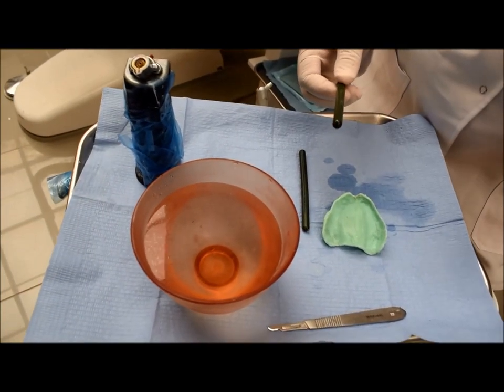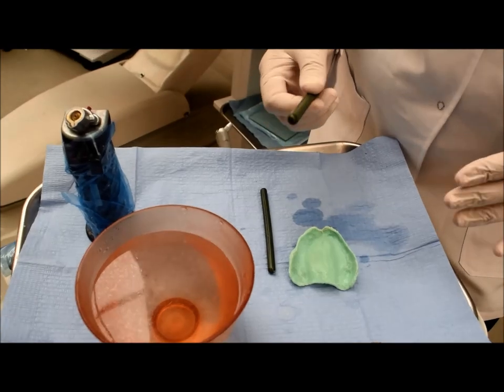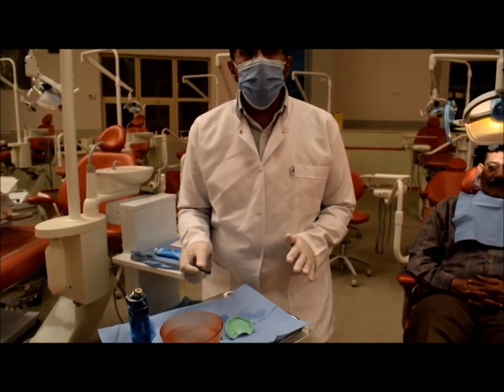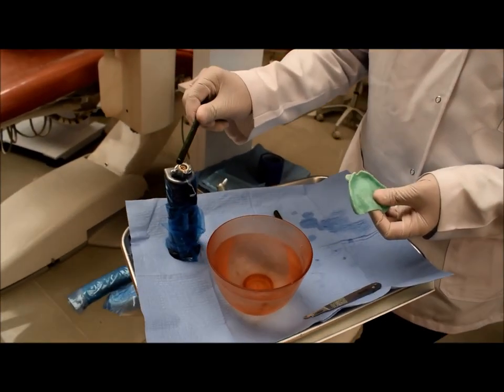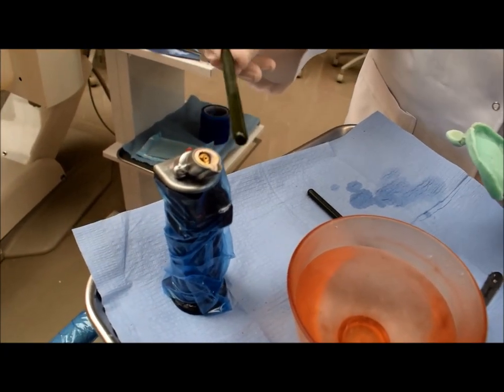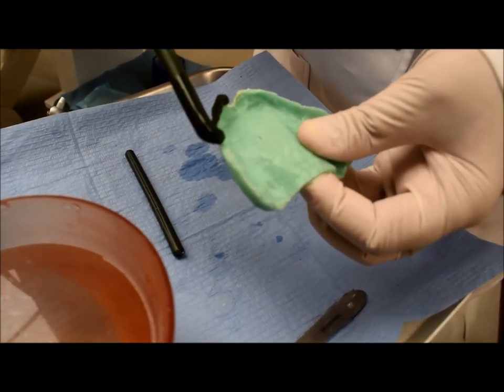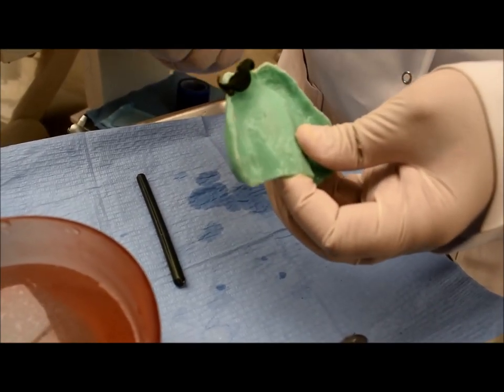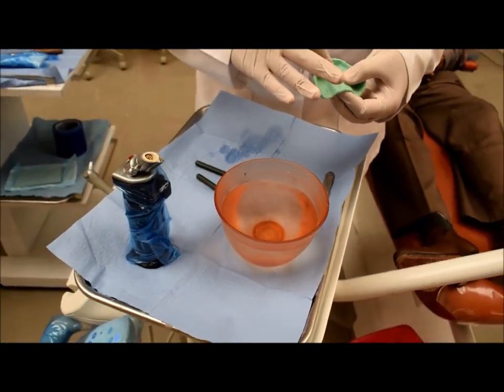There are two techniques for using green stick compound. It is a thermoplastic material that can soften either by using a torch or using hot water — both techniques are correct. When using the torch, we move the green stick slowly over the flame and not burn it. Then I will apply the green stick compound on the border of the tray.